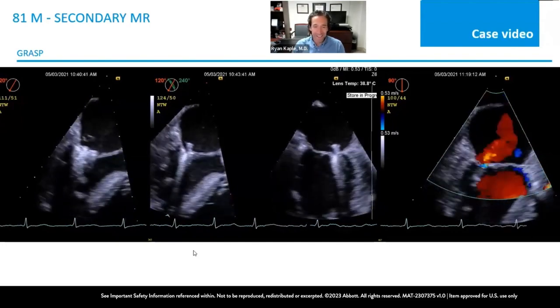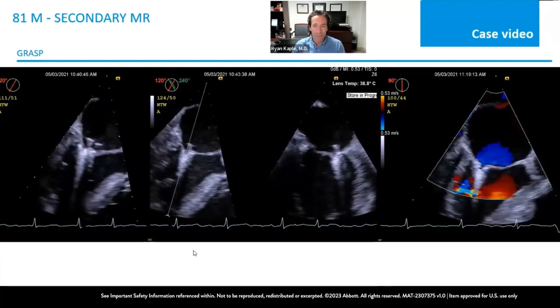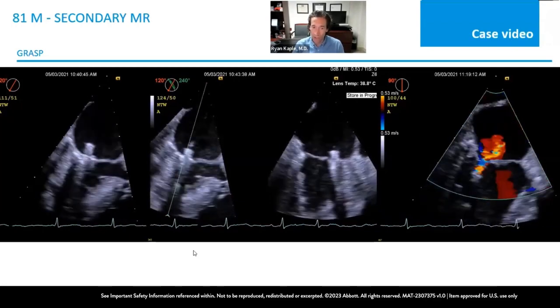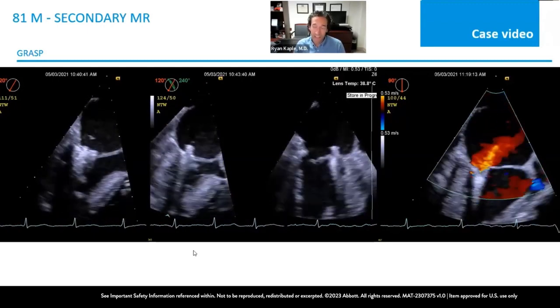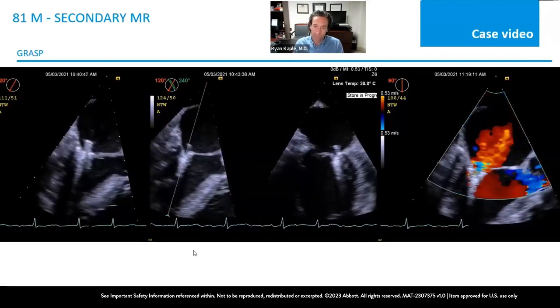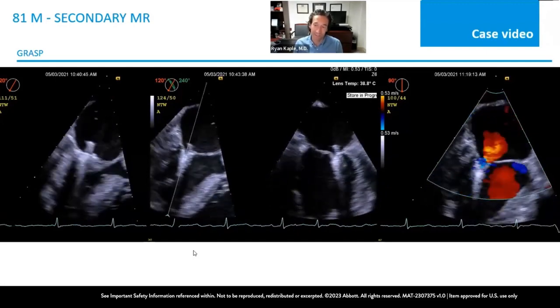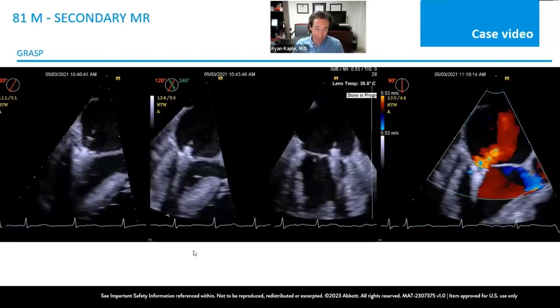That being said, it's hard to completely reset and make a new transeptal because of the steps that are involved. But also the maneuverability with the newer generation delivery system usually allows you to overcome a suboptimal transeptal. Now, the caveat to that is if you're extremely high, and you can't bring the clip down into the ventricle, that will be challenging if you can't get below the leaflets. More often, you don't give yourself enough height, and then you can't come high enough to properly engage the leaflets.